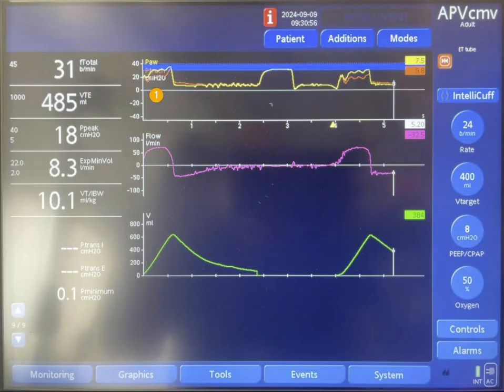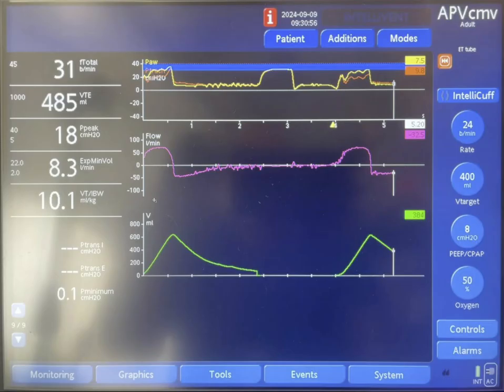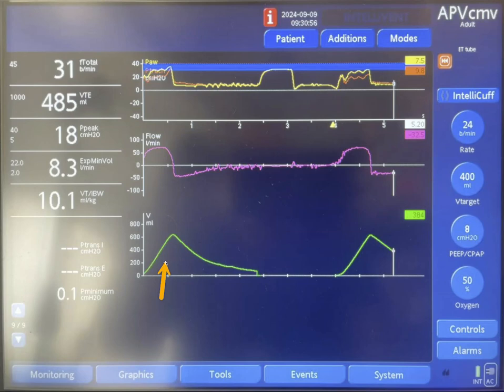We're going to be looking at the first breath, the second one, and the third one. This first breath seems to be patient triggered, very similar to the third one which is also patient triggered. The pressure goes up to 30 cm of water for the duration of inspiration. The flow goes up to around 70 liters per minute and then decelerates. With this inspiratory flow, the tidal volume goes up to 600 ml, which is much larger than the set tidal volume of 400 ml.